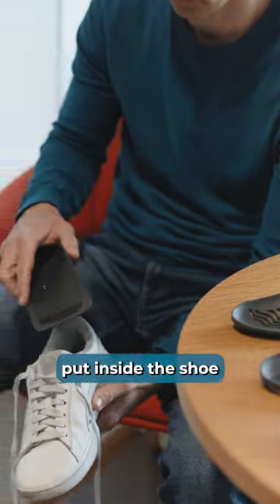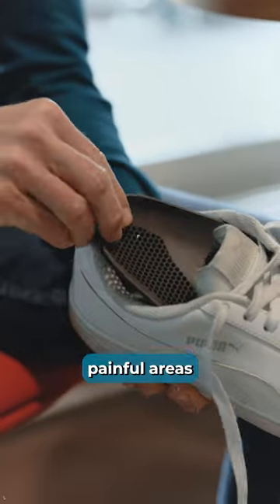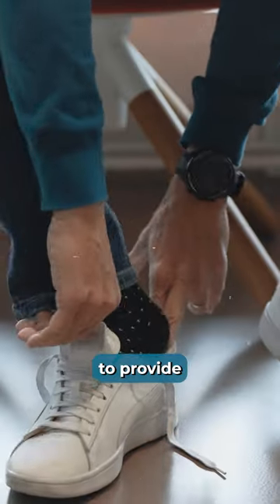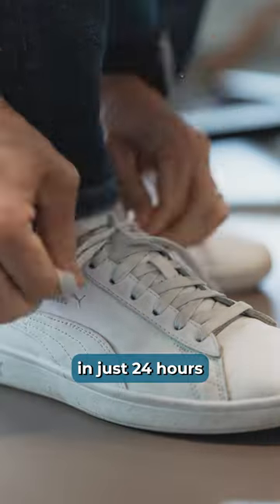The insoles are then put inside the shoe, where they help to relieve painful areas or correct malpositions. Surely an innovative and cost-effective way to provide customized treatment in just 24 hours.